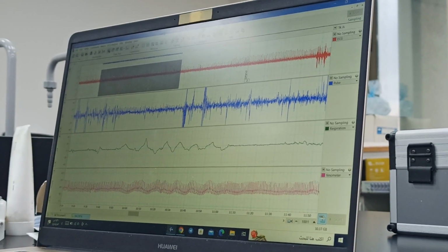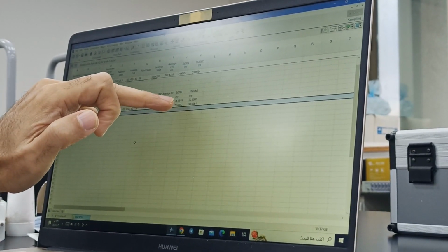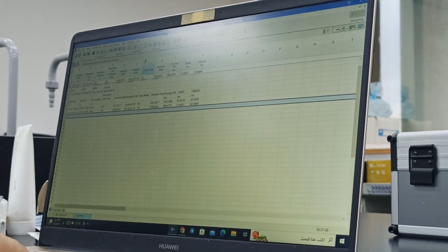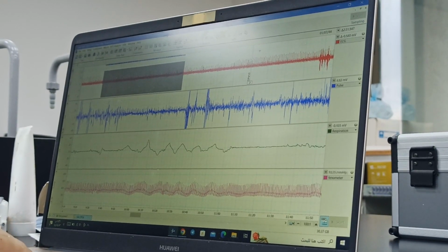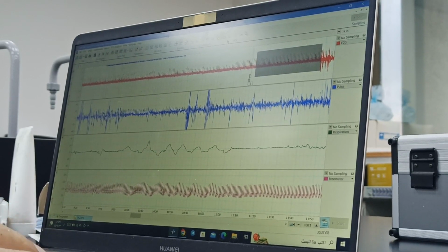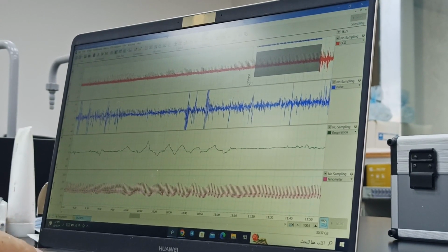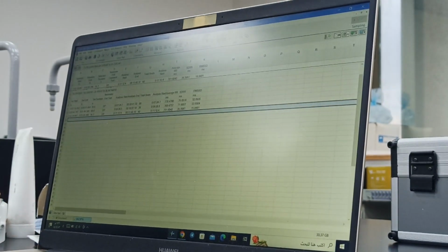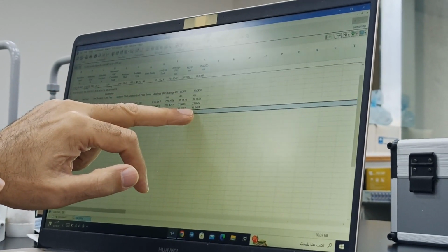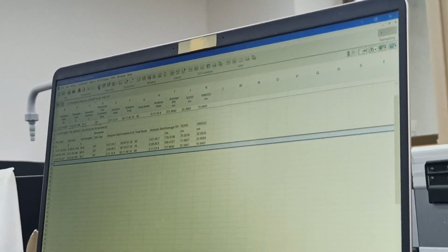Now see, 770, 769, almost same because this is all in deep breathing. Now we go outside deep breathing. Say this area. Analyze. So good, so just add. Immediately RMSSD has gone to 15 and the SDRR 35. So in deep breathing the variation is much more exaggerated.